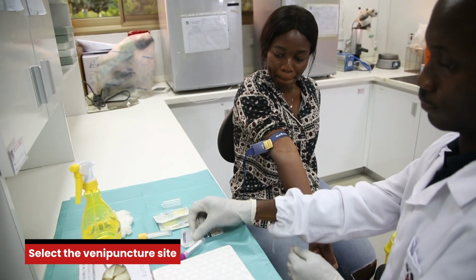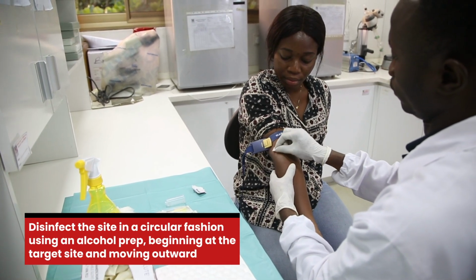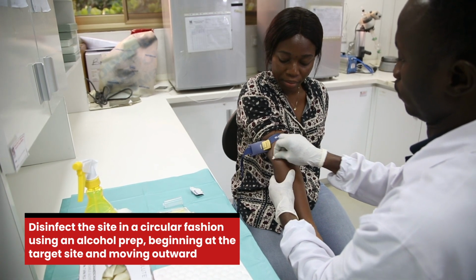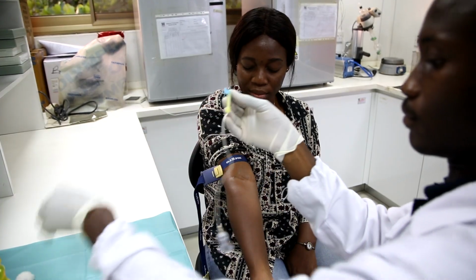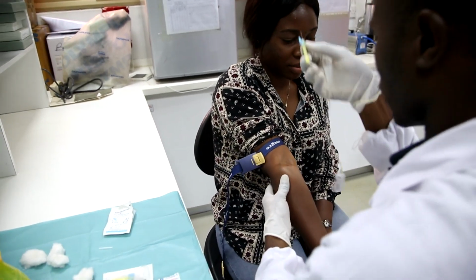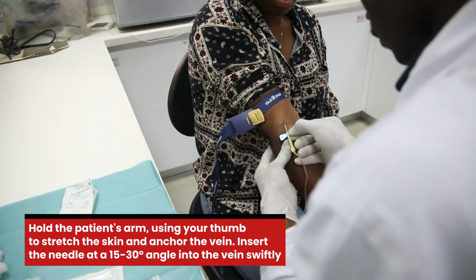Select the venipuncture site. Prepare the patient's arm using an alcohol prep. Disinfect the site in a circular fashion, beginning at the target site and moving outward. Allow to air dry. Do not touch the clean site when entering the vein. If accidentally touched, do the disinfection once again.